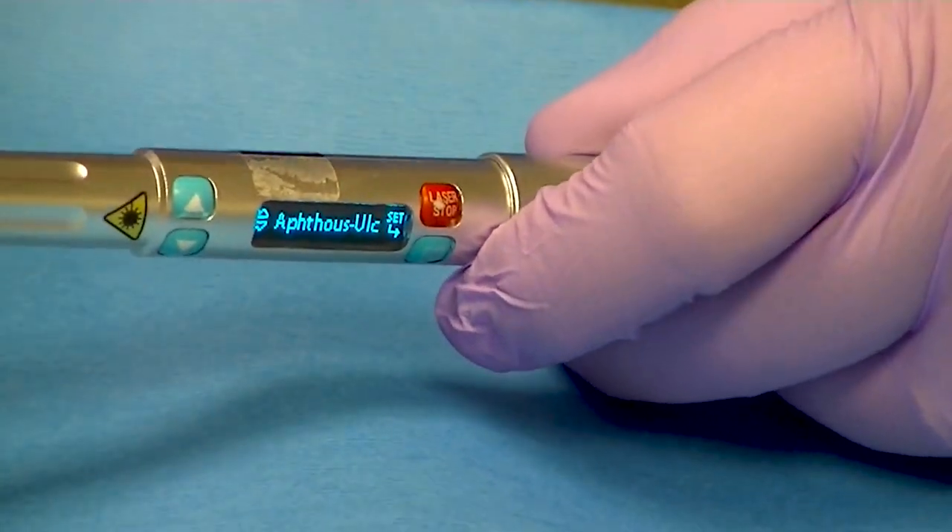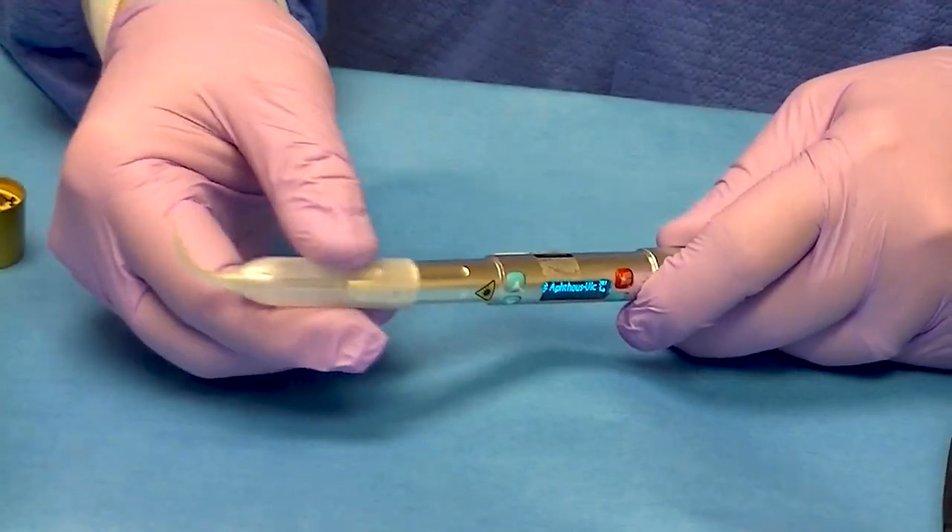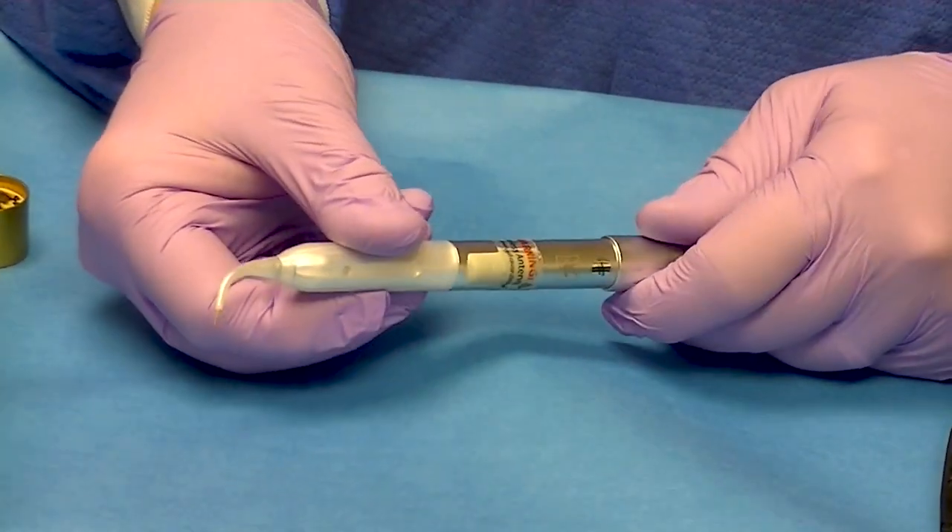One other thing I wanted to show you was putting on the tip. These are disposable tips and it simply slides on completely.